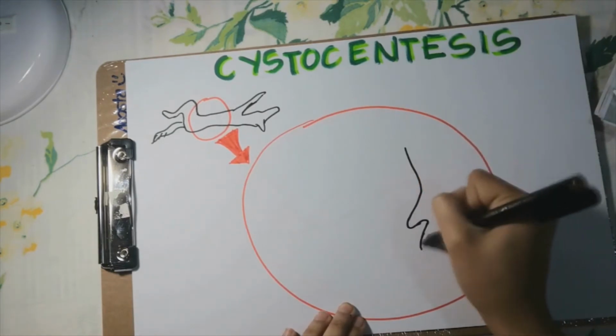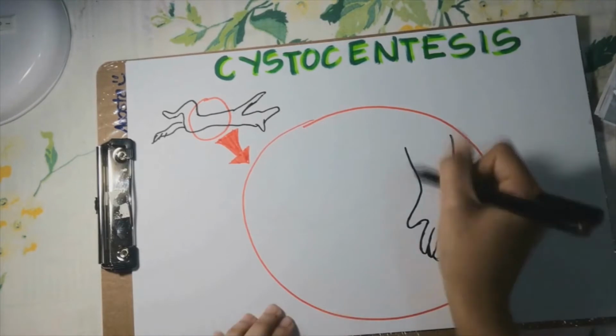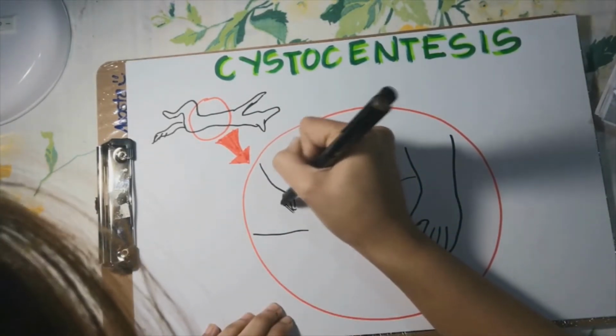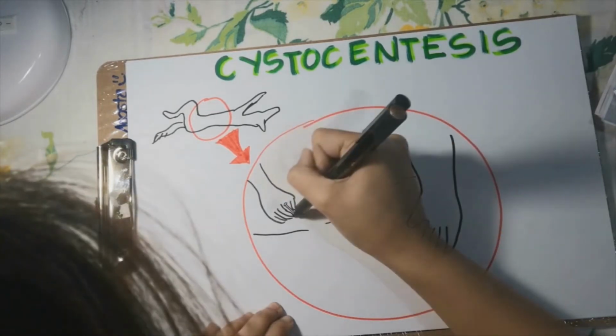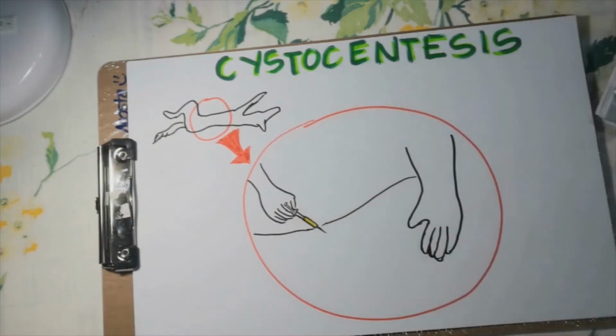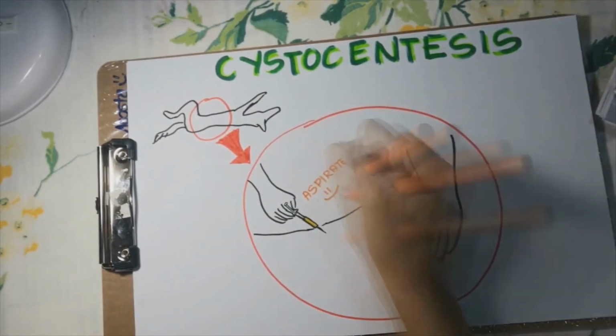This type of sample is ideal for assessing the bladder and kidneys and for detecting bacterial infection. However, the disadvantages of cystocentesis are that the method is slightly more invasive than other methods and it is difficult to do in patients that are uncooperative.